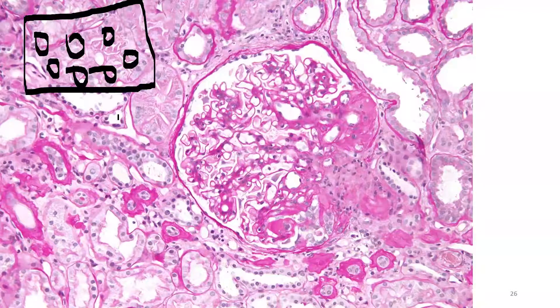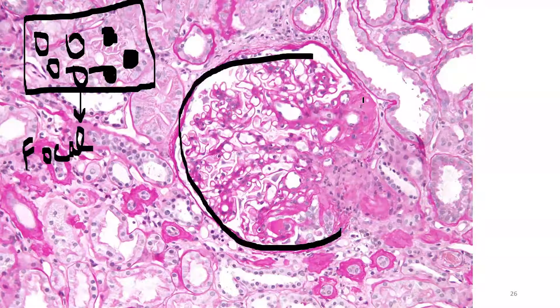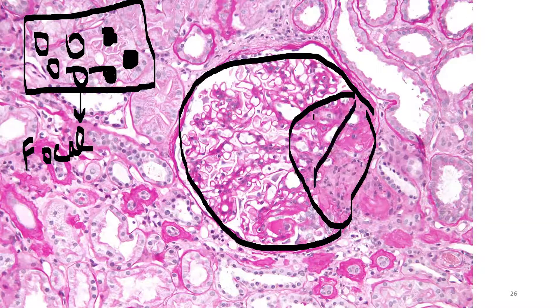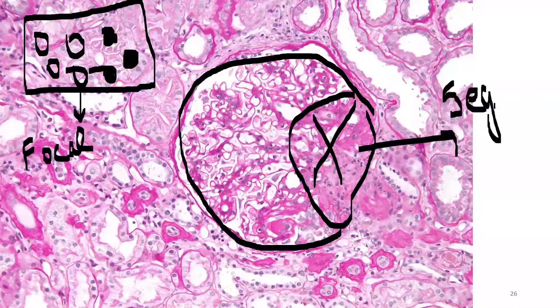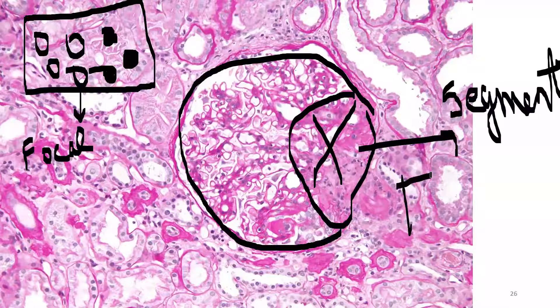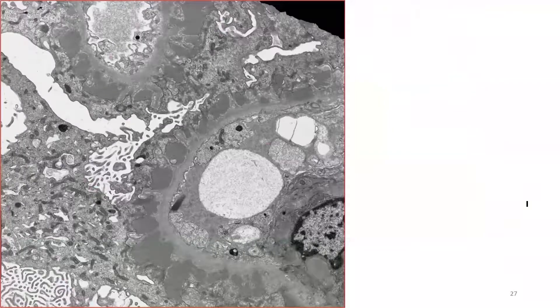This next slide shows focal segmental glomerulosclerosis (FSGS). At high magnification, only some glomeruli are involved (focal), and within a single glomerulus only a segment is involved (segmental). So amongst all glomeruli, some are involved, and even within a single glomerulus only a small part is affected — this is FSGS, focal segmental glomerulosclerosis.